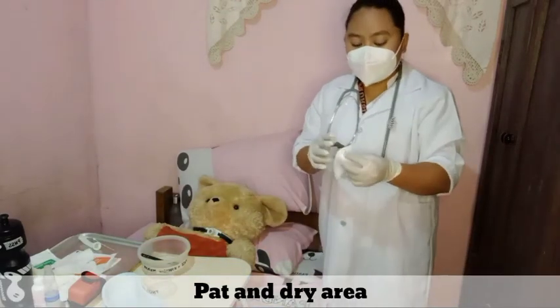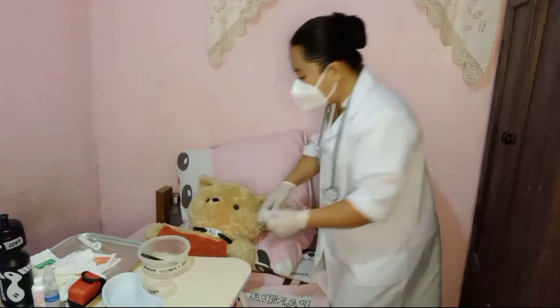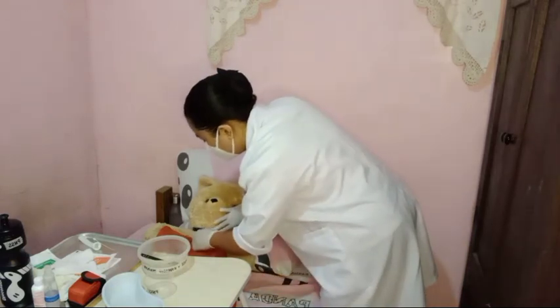Then pat the skin dry using 4x4 sterile gauze.